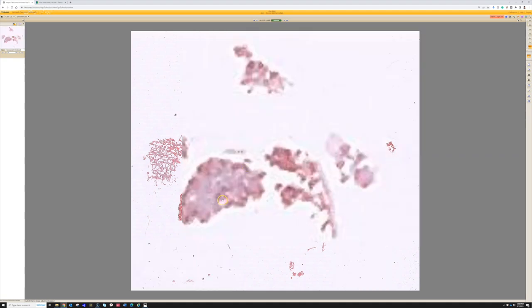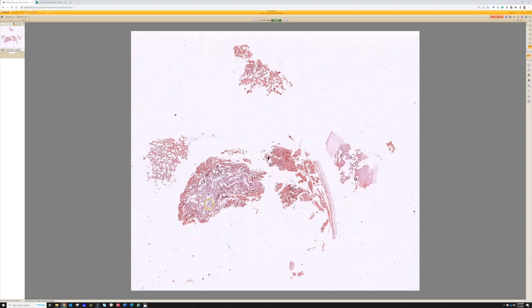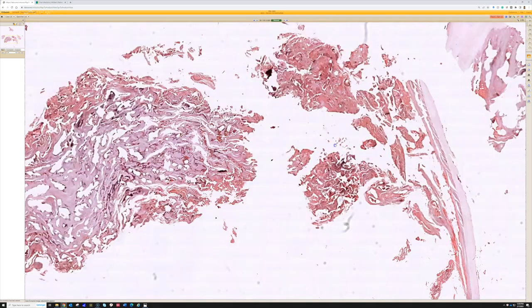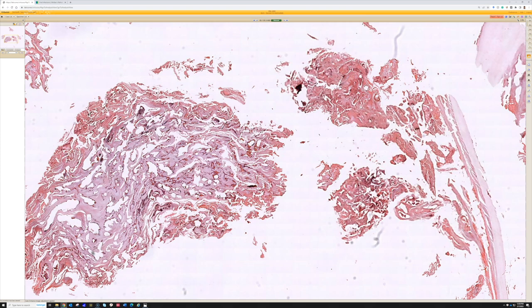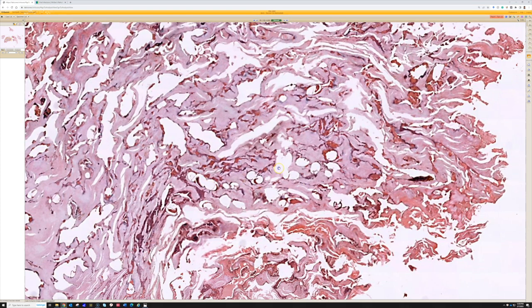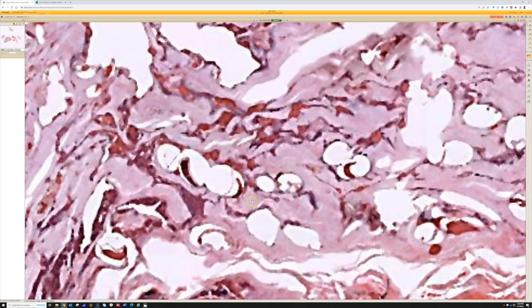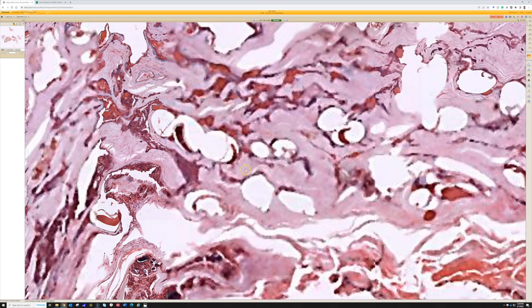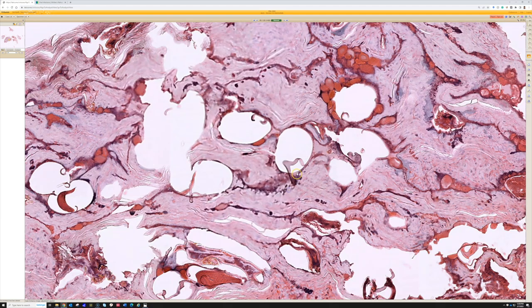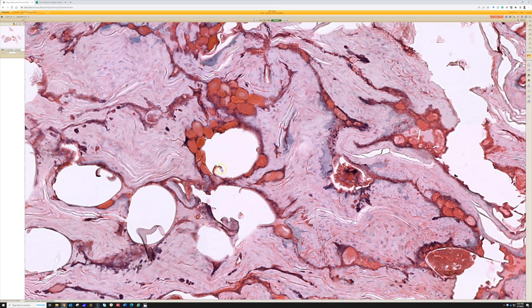Case number three — this is a nail clipping with thickened nails and abundant subungual debris. The dense compact linear piece is nail plate, and most of the other material is subungual keratin debris. When we look closer, there are multiple large holes in the keratin material, and within those holes, once it comes into focus, there are some pink wavy curvy structures. Some of these curl around in a pattern that people have likened to pigtails — little curly pink pigtails.